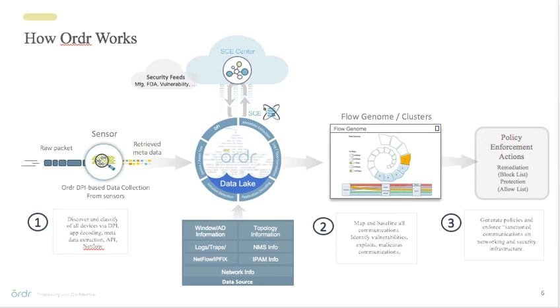It knows where the camera management system is. It knows where patch updates are being received from. But that's all that camera should be doing. Likewise, an infusion pump will learn all the communication that an infusion pump should and shouldn't have and be able to understand that so we can see if there's any abnormalities in conversations.